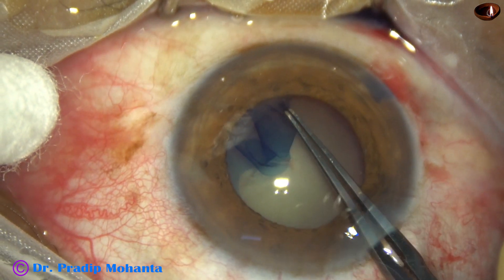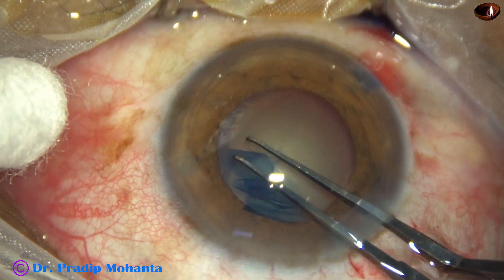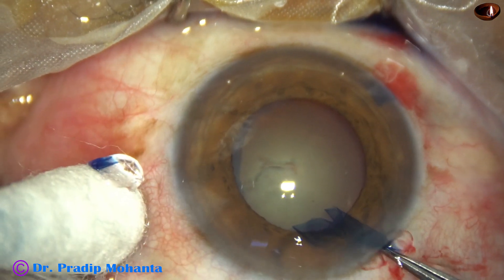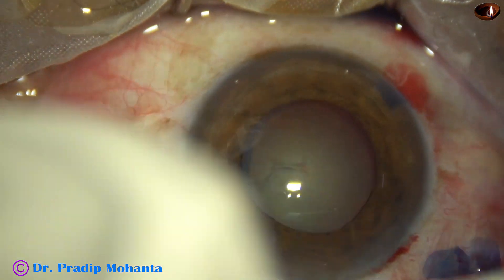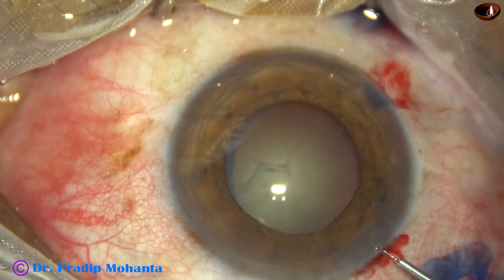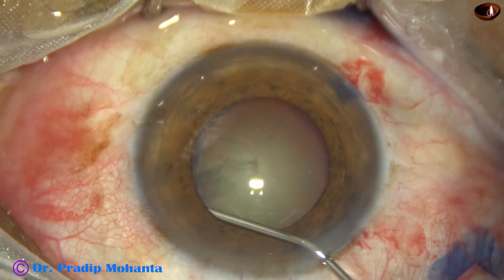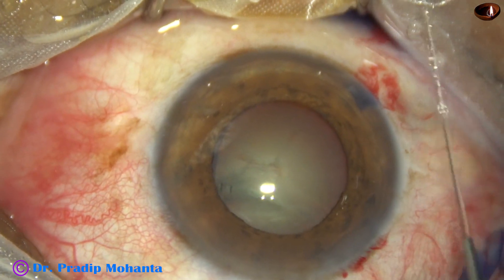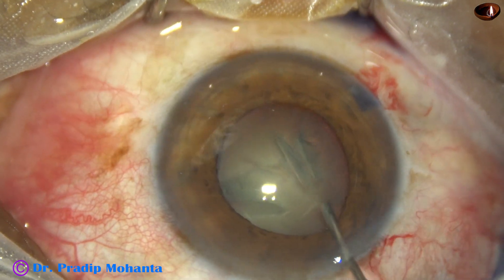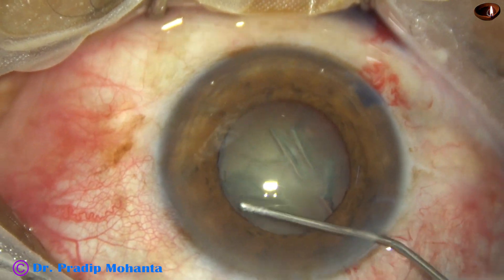This is a rhexis forceps — a utrata forceps. And now hydrodissection is to be done. I am going to try to avoid touching the iris as much as possible, because if I touch the iris, the pupil will start becoming smaller.